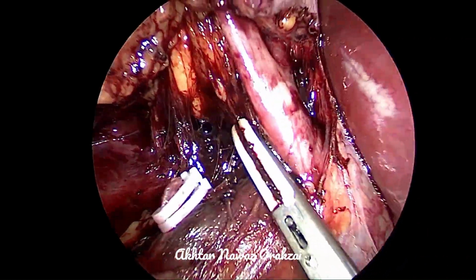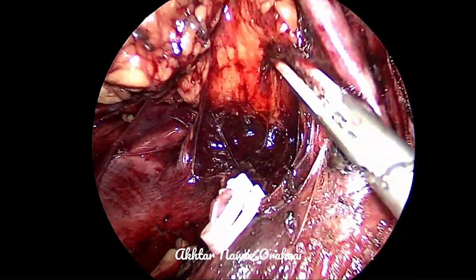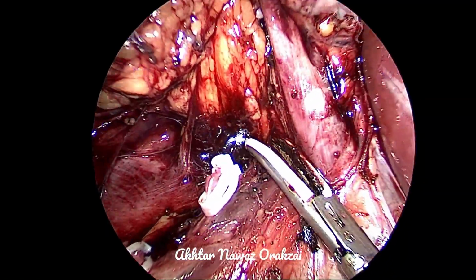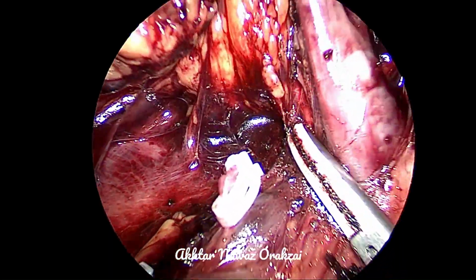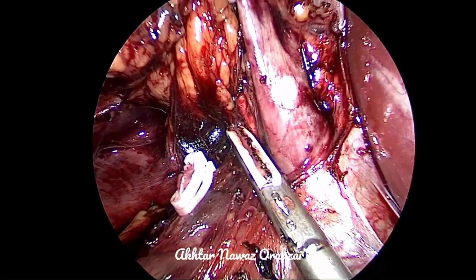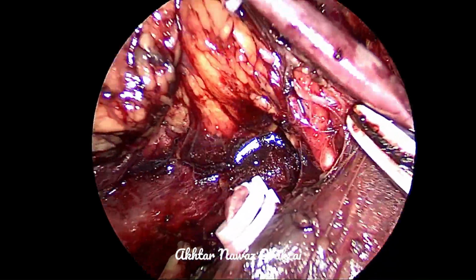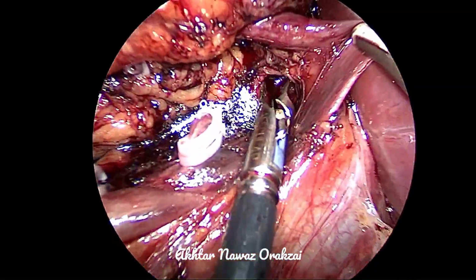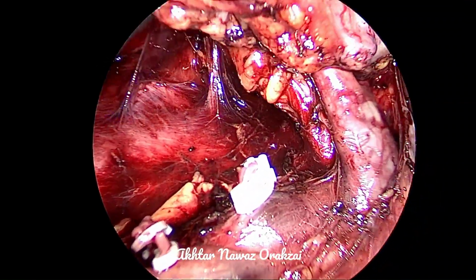So we decided to dissect around the artery in order to achieve length and in order to make a window which is big enough to accommodate the application of the Hem-o-lok clip. So the more lymphatics we divide, the more length we achieve. A little dissection between the renal vein and the artery. It is not without danger to grab the vein with the ligation.